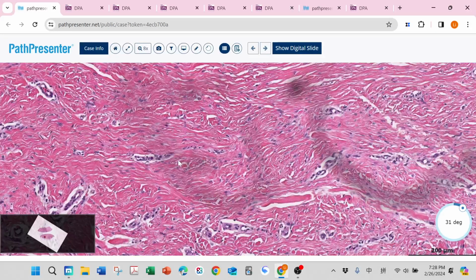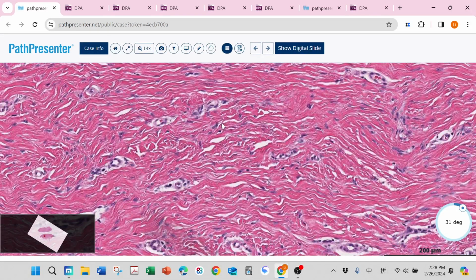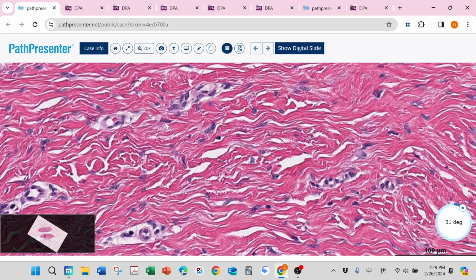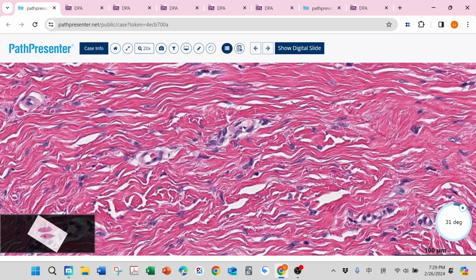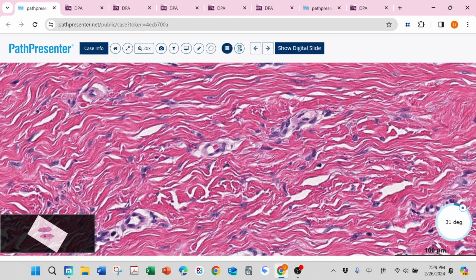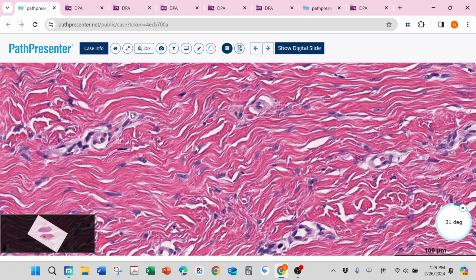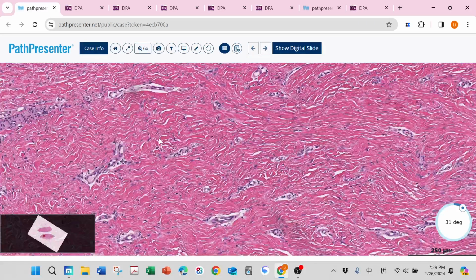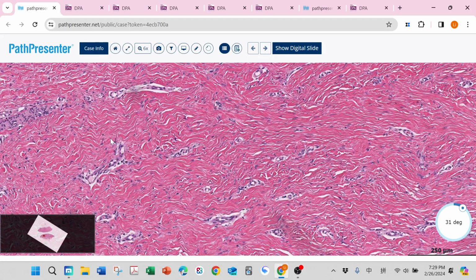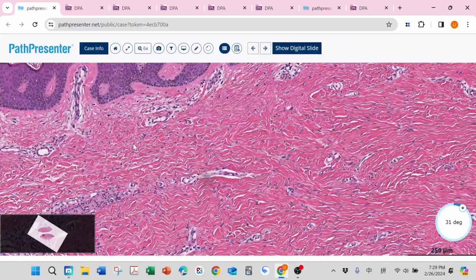And then when you see the cytology of this cell, it is kind of polymorphic but still bland looking. They do not look identical. They have different size, different shape, but not really atypical cells. They didn't form any structure, not forming storiform, fascicular, or herringbone growth pattern.